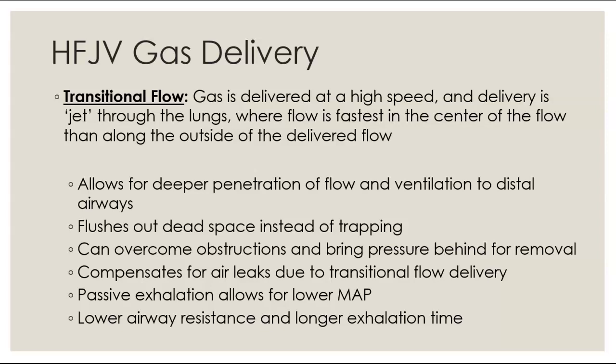So we also have lower airway resistance, as this transitional flow allows for it. If there is an obstruction or stricture or something along those lines, it helps move past it, and then there is a longer exhalation time.